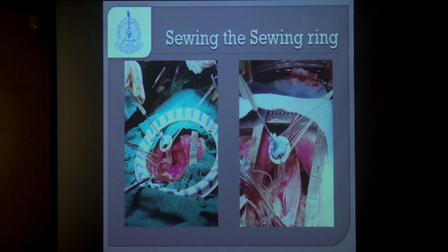How do we place the mitral valve? The mitral valve is generally placed perpendicular to its original bileaflet position. Why do we do that? Firstly, in case of a total chordal preservation, placing the mitral valve perpendicular to the structures does not cause any LVOT obstruction, and secondly, it provides us with better hemodynamics.